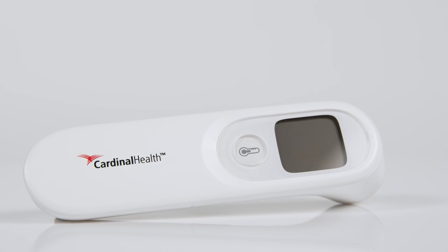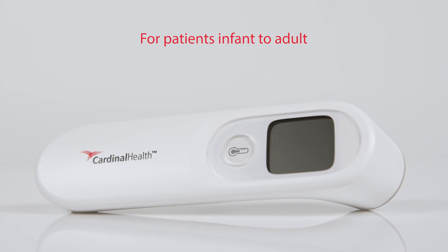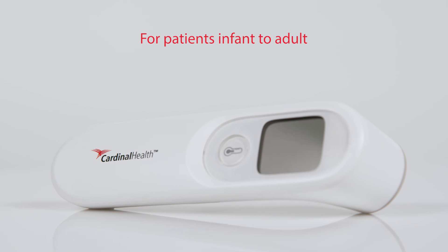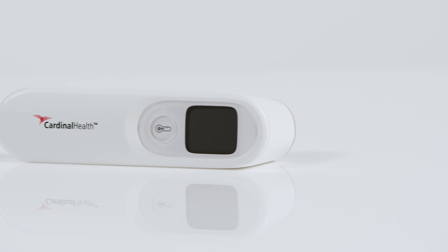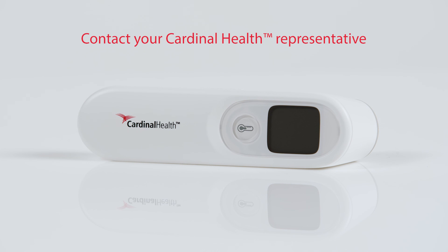The NCIT is safe and suitable for use as a screening tool or in other patient care settings, and can be used on patients from infant to adult. To find out more about the Non-Contact Infrared Thermometer from Cardinal Health and our family of monitoring products, please contact your Cardinal Health representative.